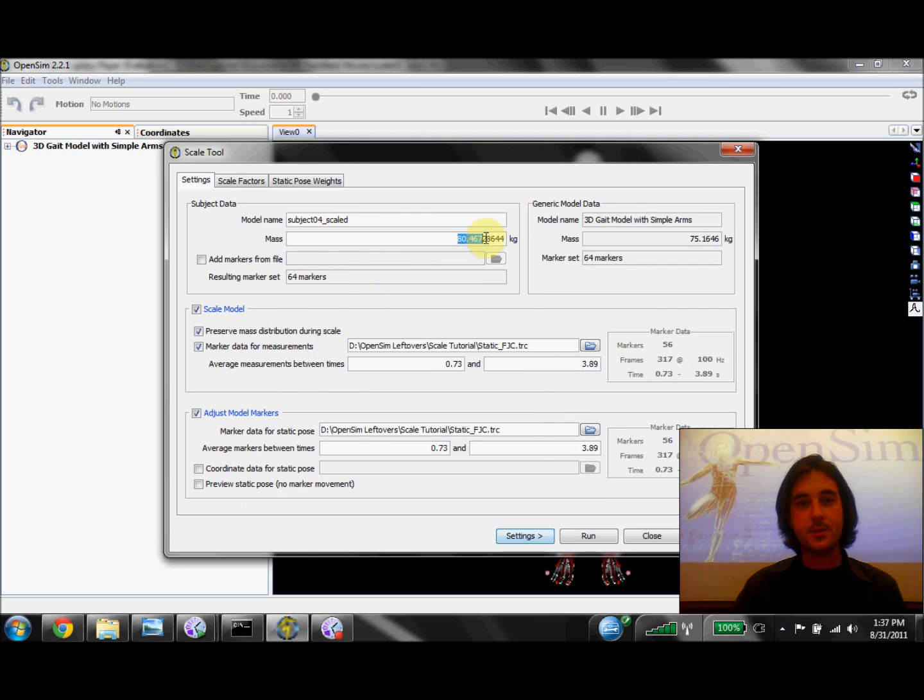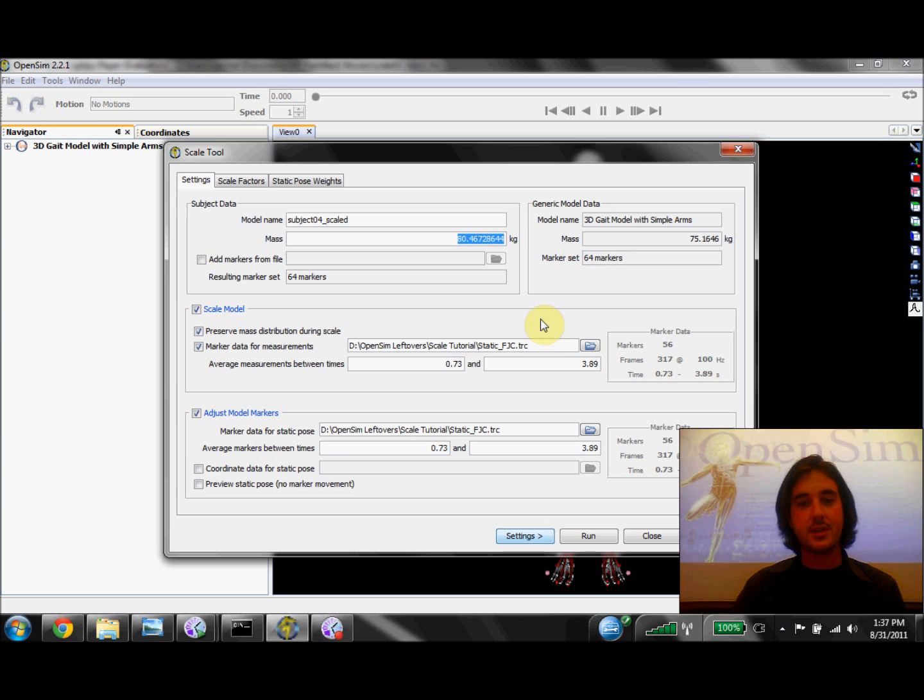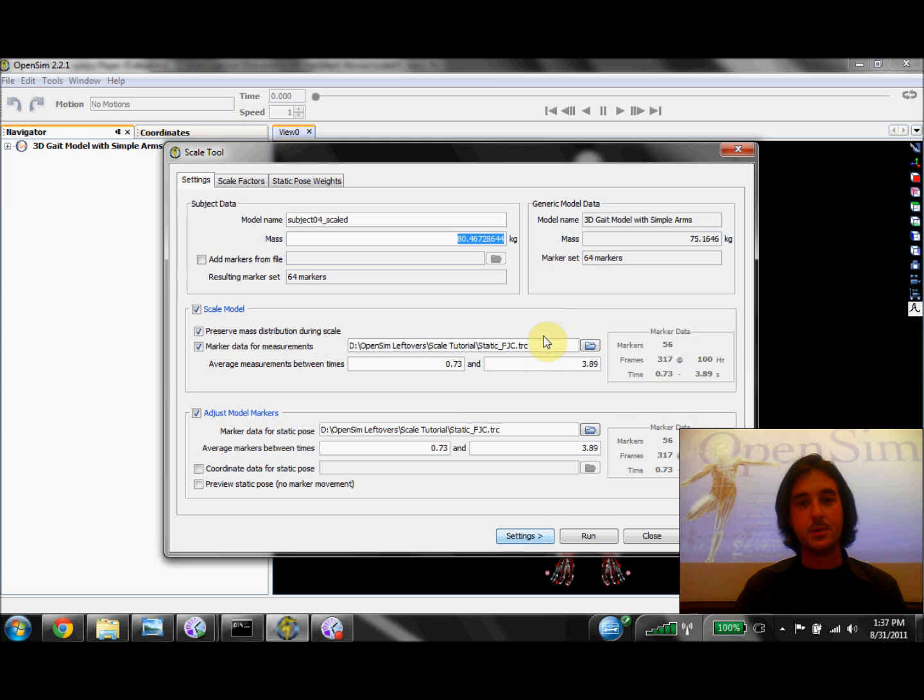First, we've specified the mass of our subject which we'd measured during the trial. We've also specified the file that contains the marker data from the static trial we collected of our subject. This is actually specified in two spots.